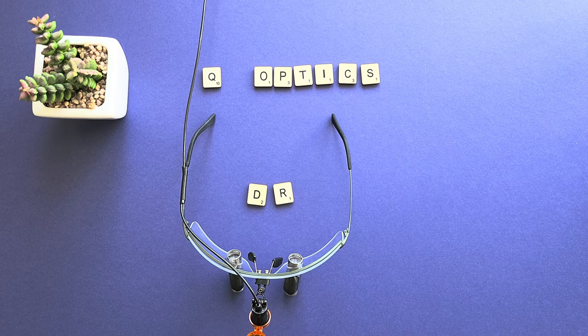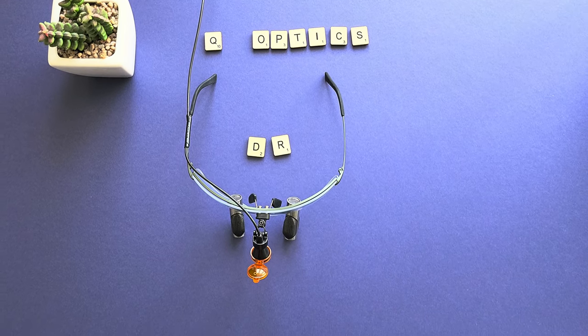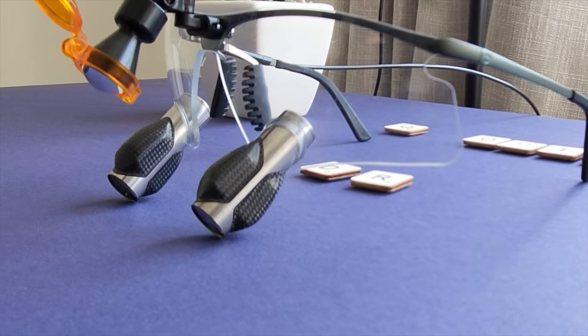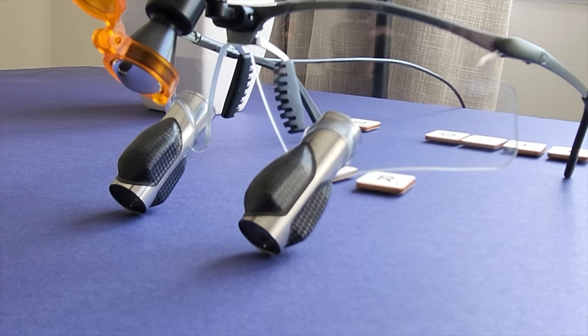For the review today we are looking at the Q Optic loupes. Some of you may know about them, some of you may not. When I was in the market researching loupes I'd only seen these online — I never actually saw them in person, hence why I was really excited to get my hands on these. In the video today I'm going to discuss quite a few things in detail: Q Optics the brand, their UK distributor Swallow Dental, the design of the loupes, things I liked, things I didn't like so much, and then I'll conclude.